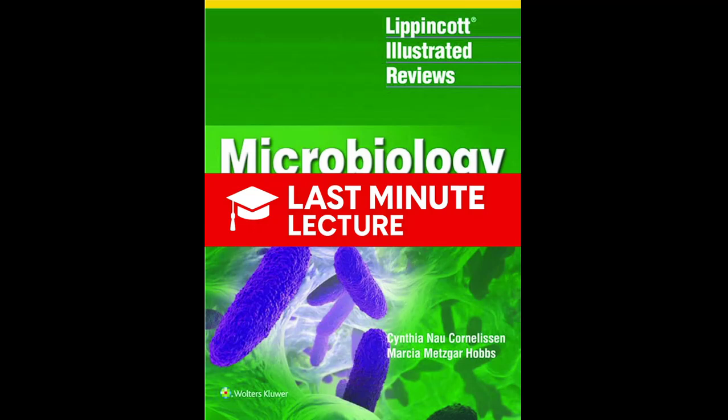With bright pink. If the bacteria, like E. coli, eats the lactose, it produces acid, and a pH indicator turns the colony pink. If it can't, like Salmonella, the colony stays a boring beige color. So one look at the plate tells you if you have a gram-negative lactose fermenter. Which is a massive clue. You've already narrowed it down so much. Okay, so we've got a pink colony. We know it's a gram-negative rod that ferments lactose. But is it E. coli or Klebsiella?